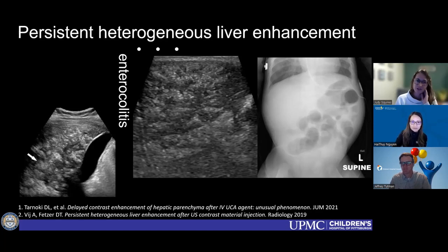Yes. Right, if you have an internal control on that patient, like the vessel adjacent to it. And we usually do it more for comparison over time, like Judy said. We diagnose it, and then following treatment, this is how it looks, or did it improve? And actually our GI team, most of the time, even do their own bowel ultrasound. They measure their own thickness and things like that, and sometimes only refer for problem solving, or if they want to take them to surgery. So it's an inconsistent service, and I don't have a set standard protocol yet.